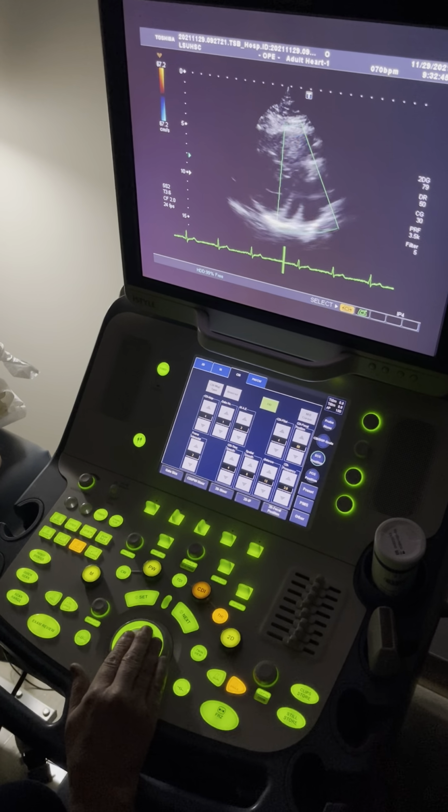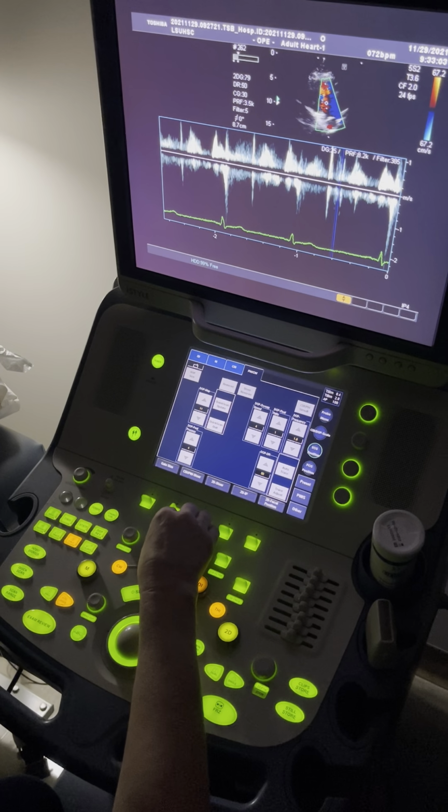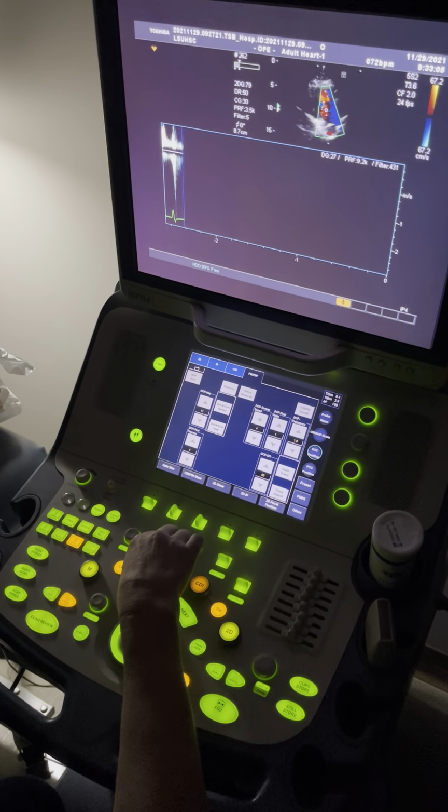So there, as you would commit, you would turn on to color. If you see the TR, and I know Paul has some, call up your cursor, drop it right through it, go to CW, baseline, scale.